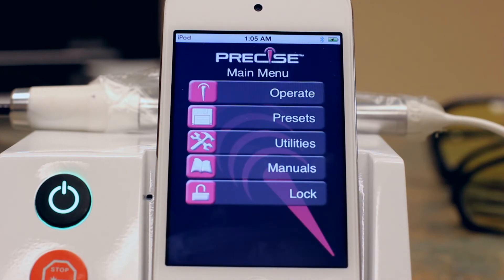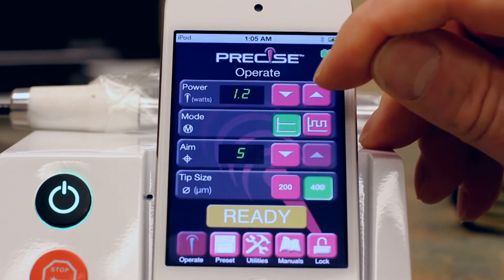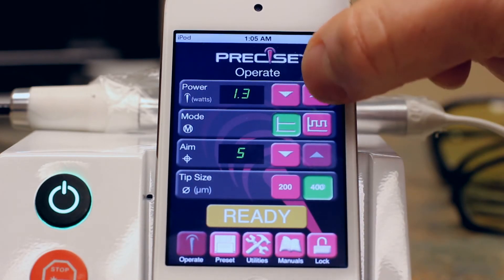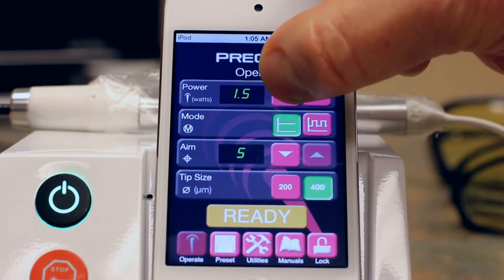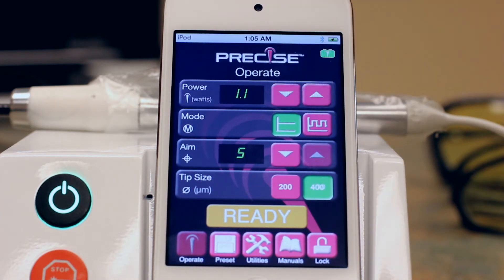The Precise SHP emits laser energy at a wavelength of 810 nanometers. The intensity of the energy can be selected between 0.5 and 3 watts in 0.1 watt increments by simply pressing the down arrow or up arrow buttons to select the laser intensity.